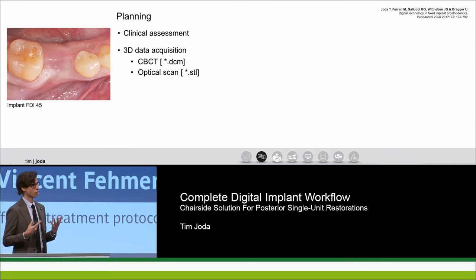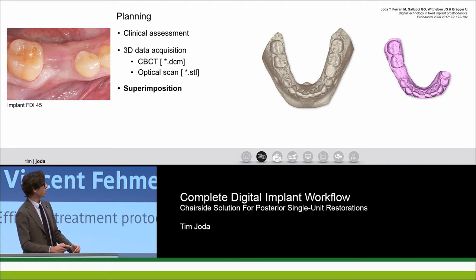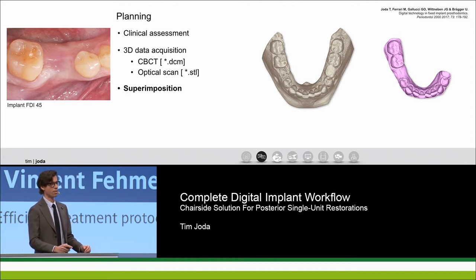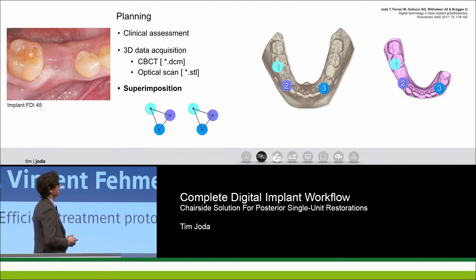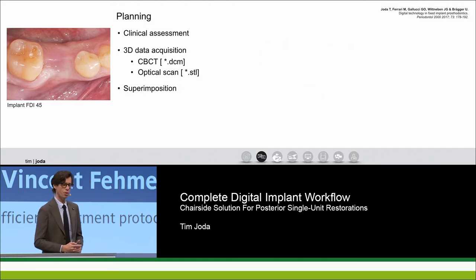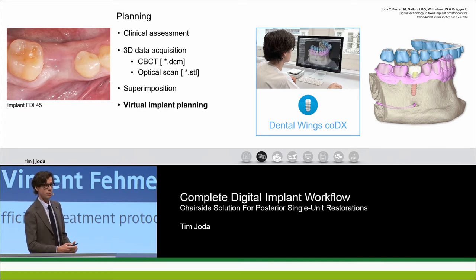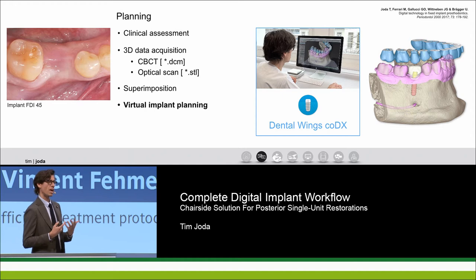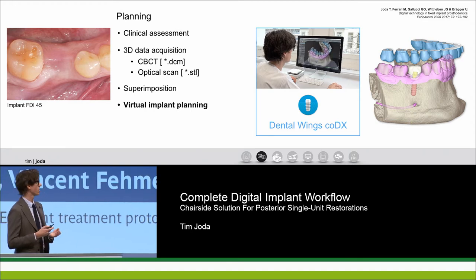The next crucial step is to merge both pieces of information. We use the program co-diagnostics for virtual implant planning — to merge the STL file, shown in pink on the right, with the DICOM file on the left. We need at least three corresponding reference points to superimpose them. It's really important to have the cone beam CT include the opposing arch, because we work entirely digitally without any physical models.